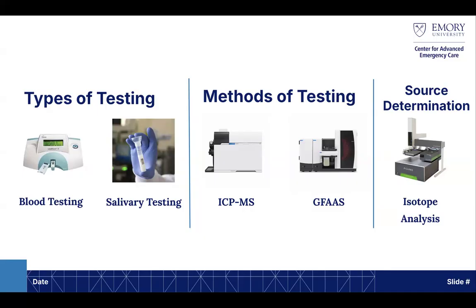First of all, having access to laboratory testing is essential. Many countries around the world do not have these technologies, whether we go from the LeadCare analyzer to the more sophisticated definitive methods.